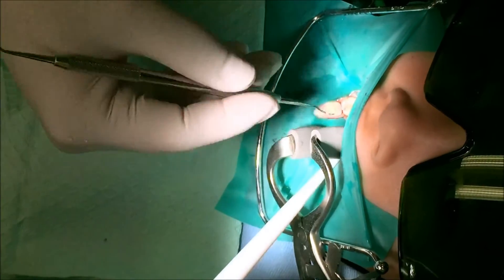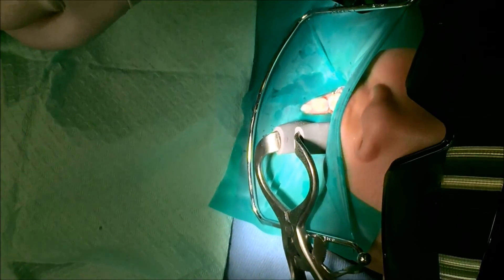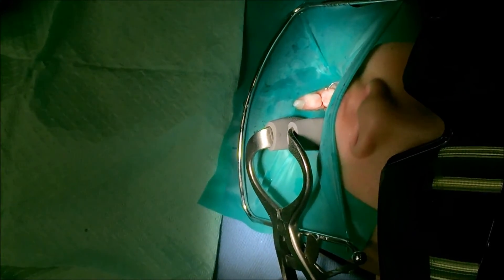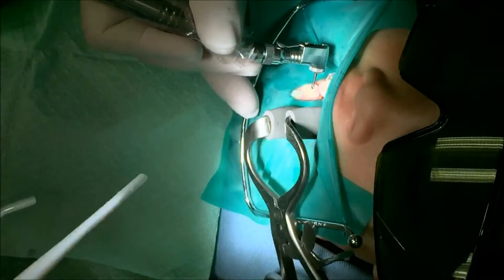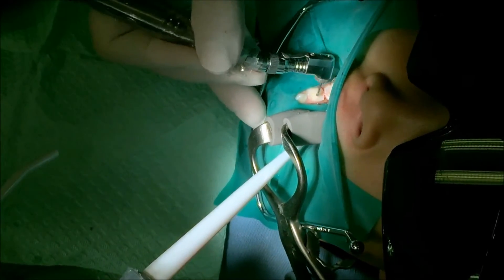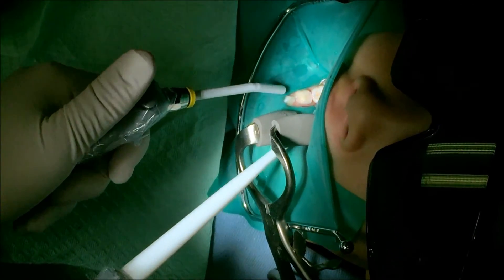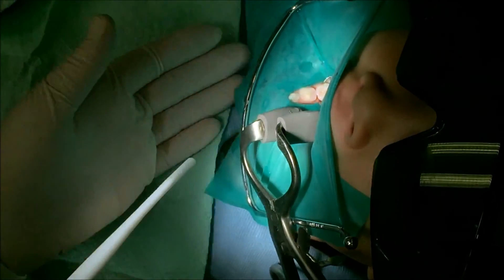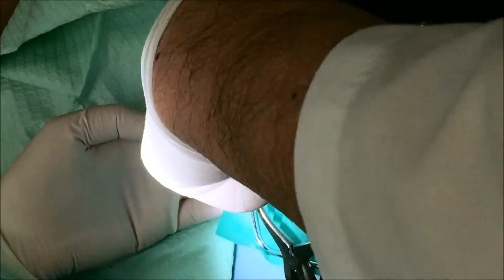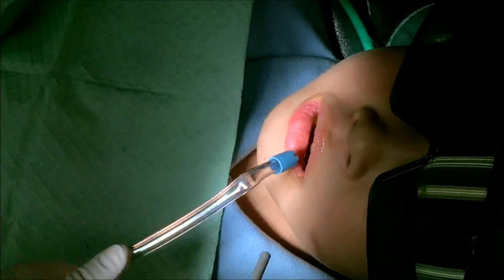That's the number six round, please — not the white one, the regular six for polishing. I'm going to smooth out the chewing surface here so it won't be bumpy when you eat. Good job. I'm going to smooth this one more time. Alright, so we're going to floss your tooth — make sure you can floss — and then we'll take everything out. Perfect. I'm going to take the ring and the umbrella out. Awesome.